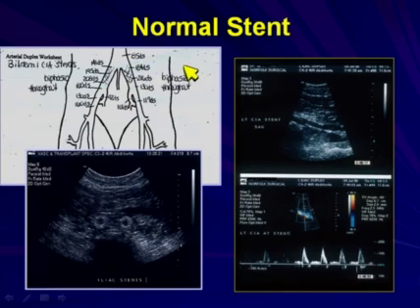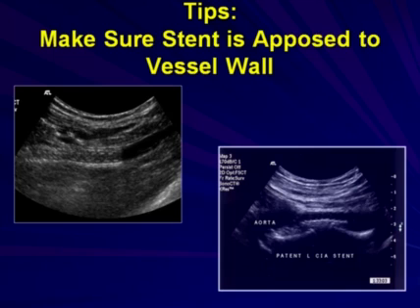Usually if the patient has had a full aortoiliac and this is just a follow-up to a post-procedure stent, we would just do the terminal aorta and then look at the whole segment of the iliac since both iliacs were treated. We would walk the Doppler right on through the segment of the treated portion or of the stented iliac and confirm all of that with spectral Doppler in several areas.